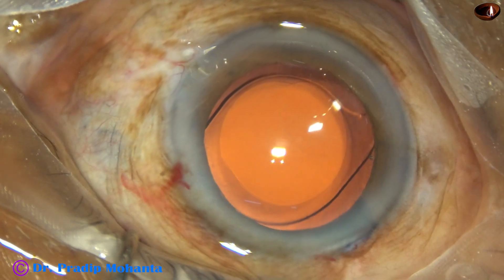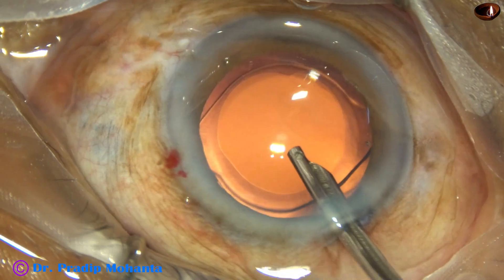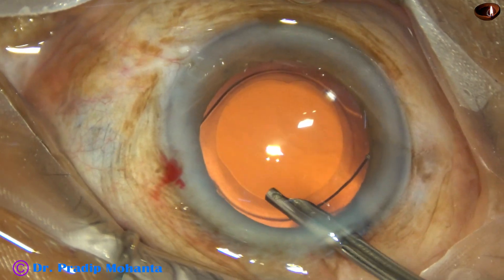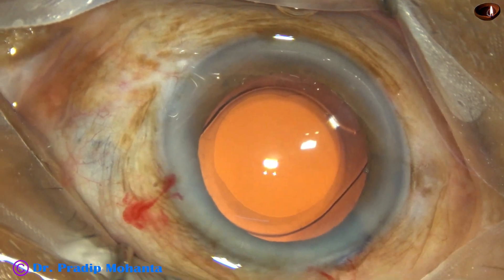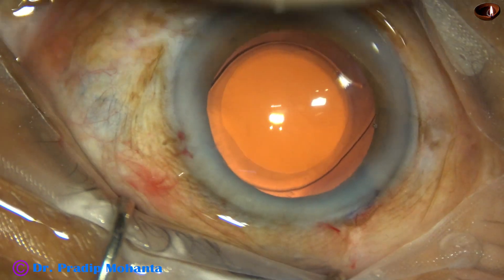This is the final lavage of the anterior chamber. The sideports are closed by corneal stromal hydration with BSS. The anterior chamber is nicely formed with the Simcoe. Integrity of all the wounds is checked, and the case is concluded.